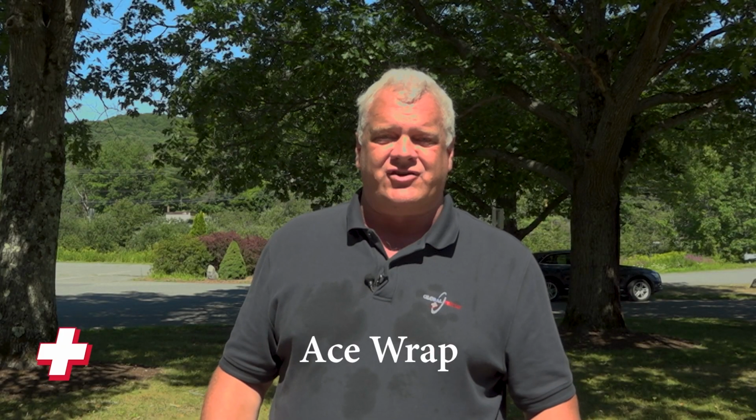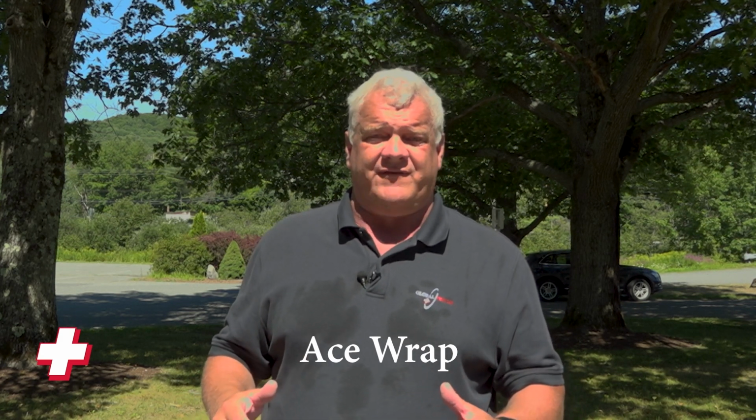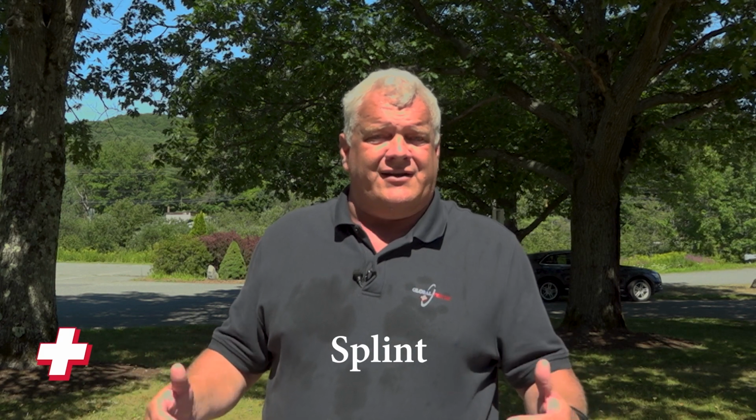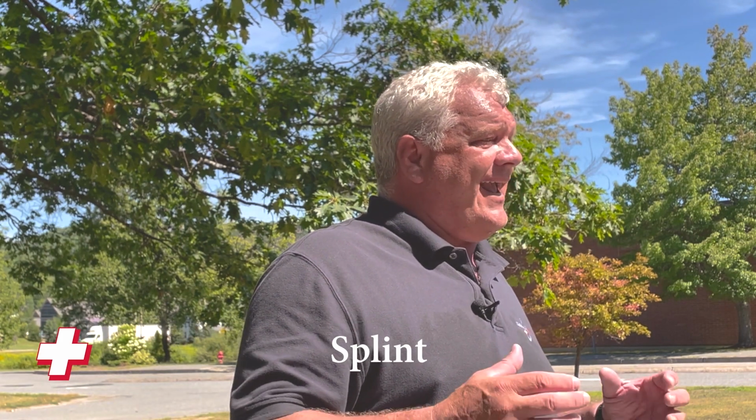Immobilizing joints or fractures. Not much you can do for these except to stabilize them to make the patient more comfortable until the emergency provider arrives. That's done with splints. You can make a splint out of anything that you can find in the wilderness, basically. Trees, your ski pole, what have you. But there are pre-made splints that are ready to go that can be put into your first aid kit.